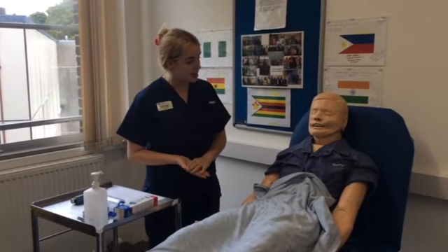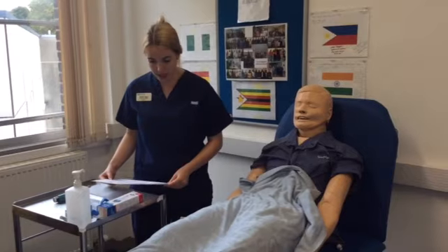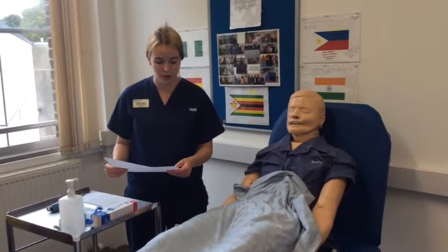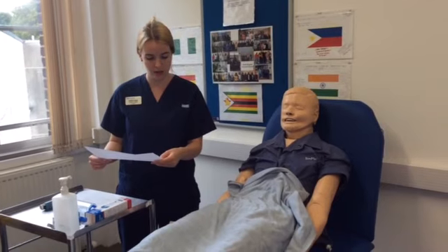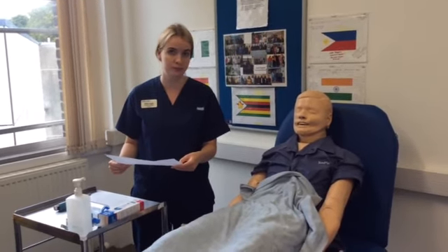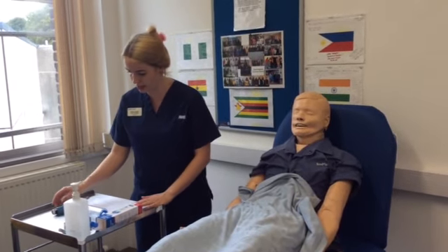So James, I'm back now. Oh, hello. Do you mind if I just check your identity again before I show you how to use the inhaler? No, that's fine. So your name, please? It's James George. Your address? 12 High Street, Poole, BH12 4PH. Lovely. And your date of birth? It's the 6th of the 6th, 2000. Okay then, James. I'll just show you how to use the inhaler now.